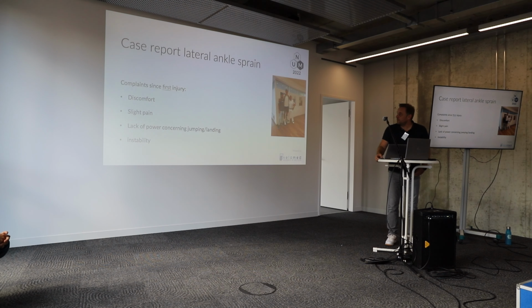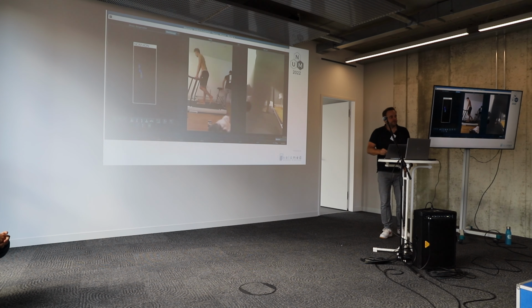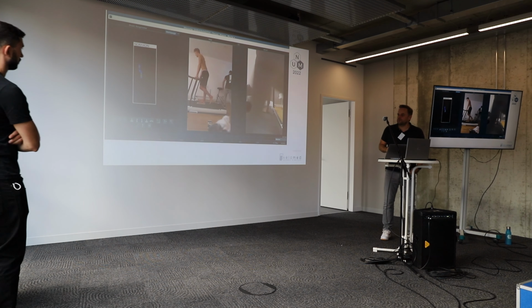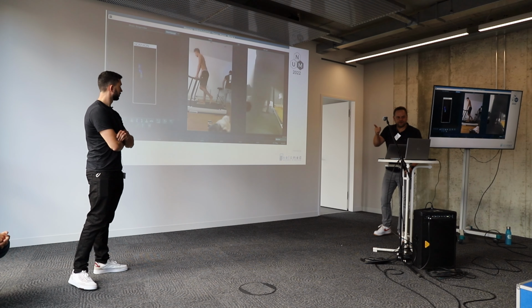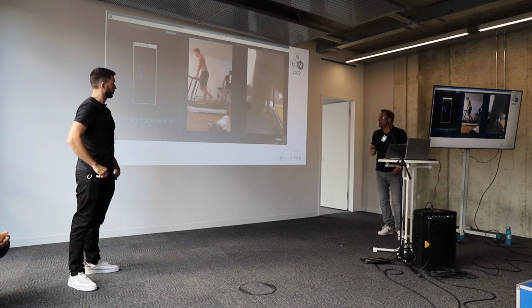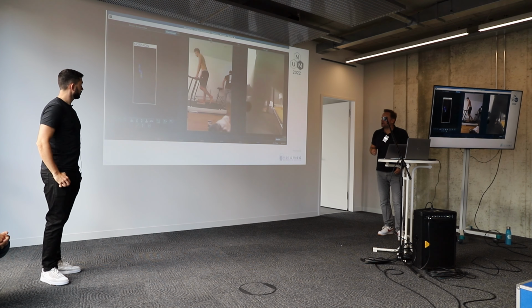So what we do with people suffering an ankle sprain, especially with athletes, is we take care of the peroneal muscle. And Toby, so we work together. So the sporties, like Nico said, he's in charge of the screening. And then we found out some very, very interesting things.